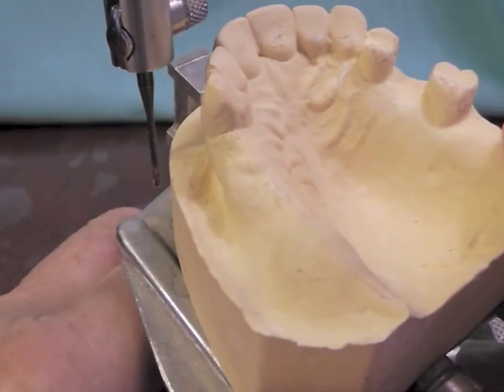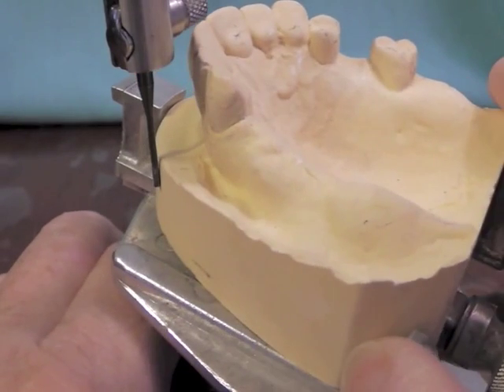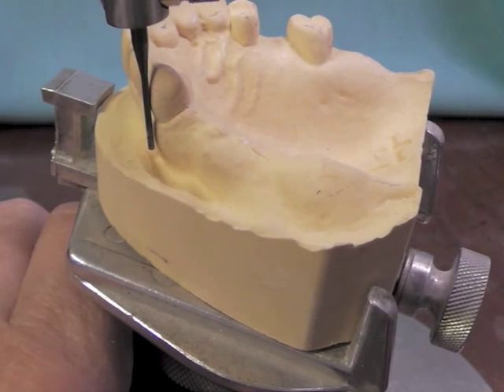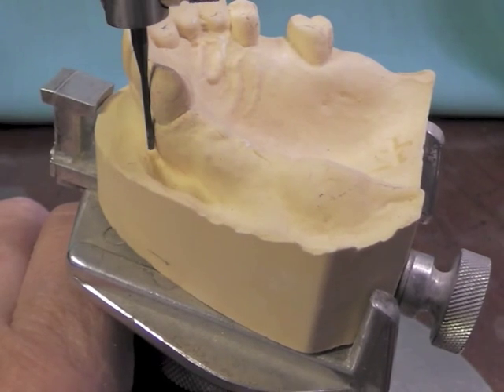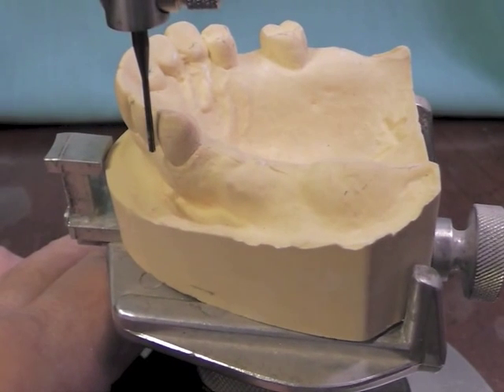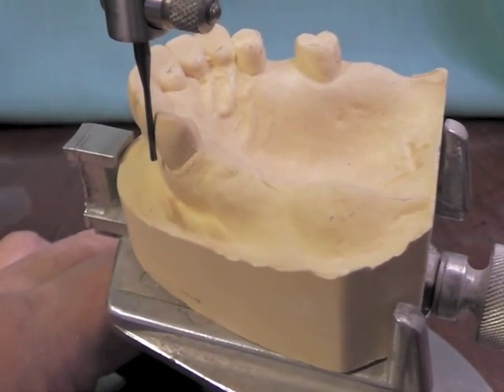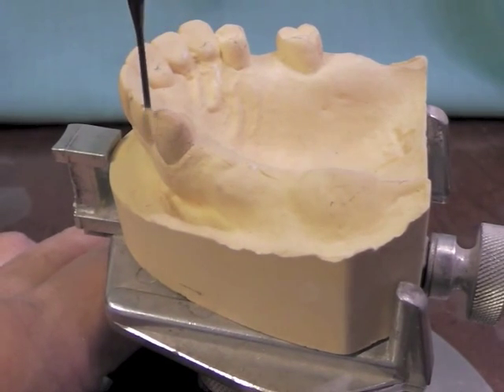We could probably tip our cast severely to the posterior in order to get that bar closer to the gingiva, but that also means we have to put it in at a rather odd angle when trying to seat it in the mouth. When the partial is all said and done and totally seated, it's usually pretty parallel — the ridges are parallel to the floor. So we'll also look at our second option, which is the wrought wire clasp, and we certainly appear to have a 0.02 mesiofacial undercut. So we would possibly consider that wrought wire clasp for that particular side.